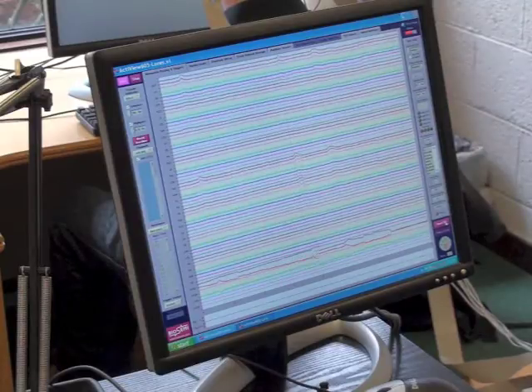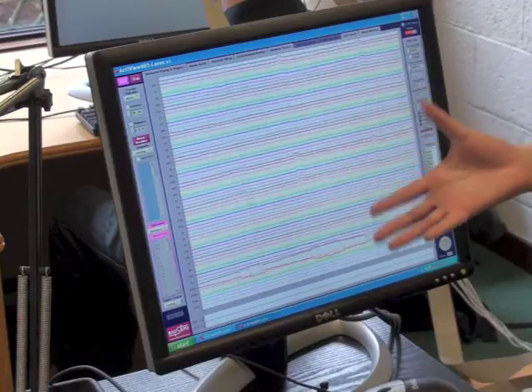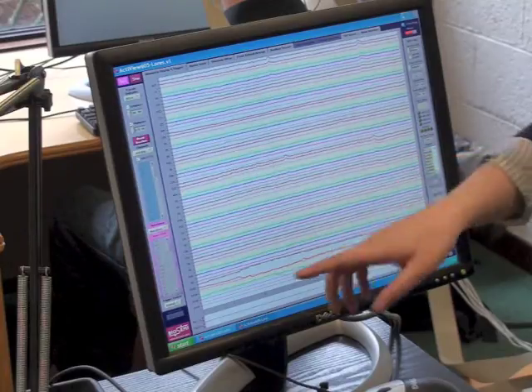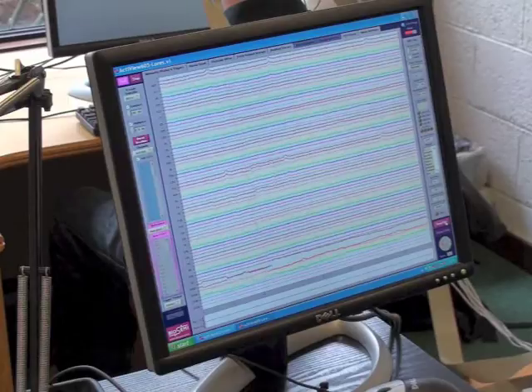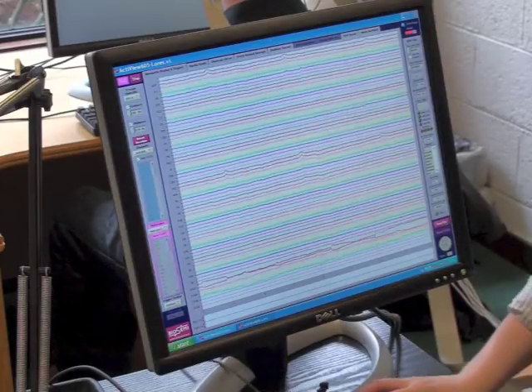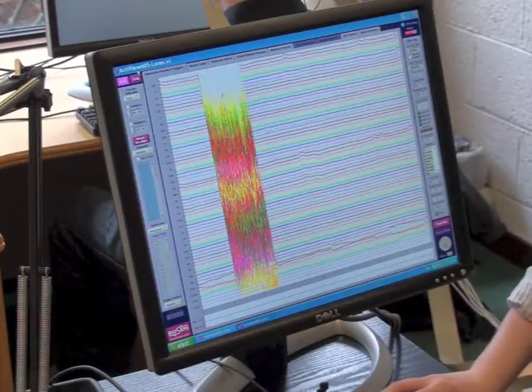And you know then that you have to just let the participant go home because it's not usable. So the trick is knowing that you can even tell that this looks kind of alright for data. It looks like in a science film what data should look like. Except I know that this should be a little bit less dense, but it's fine. Sometimes it just looks crazy on the screen, and you know then that you have to let the participant go, but also make sure you're not just looking at the data really magnified like that.